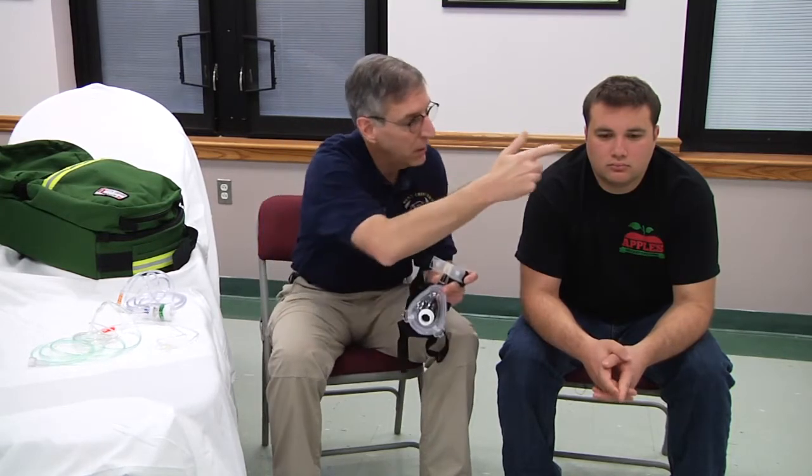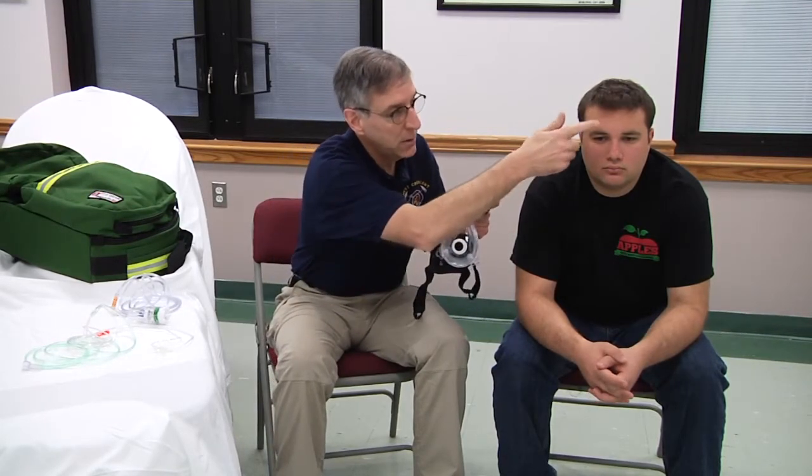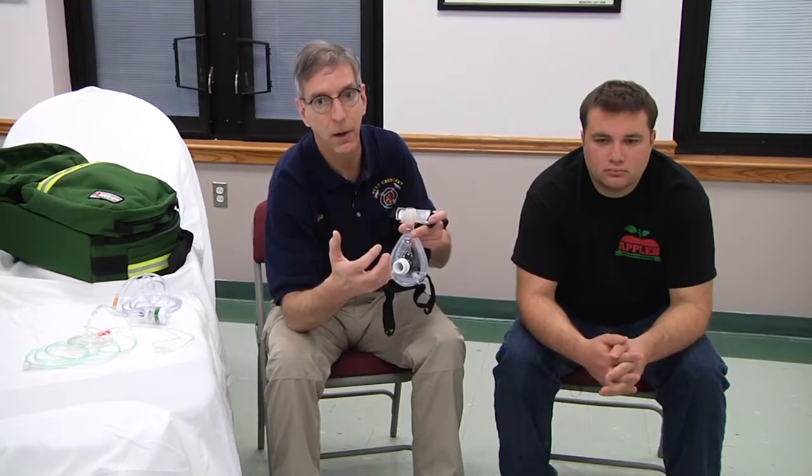The second point are the 2 corners of the mouth, which both need to be covered by the mask. And the third is where the cartilage and the nasal bone intersect on the patient. So the mask should hit all 3 of those points and cover all 3 of those points. If it's too large and you see the mask getting into the patient's eyes, or the mask doesn't adequately cover the 2 corners of the mouth, you need to pick a different size mask. If you don't have a good mask, you're not going to get a good seal with CPAP, and it will be ineffective. You can't apply it to the patient and actually gain some clinical benefit from it.